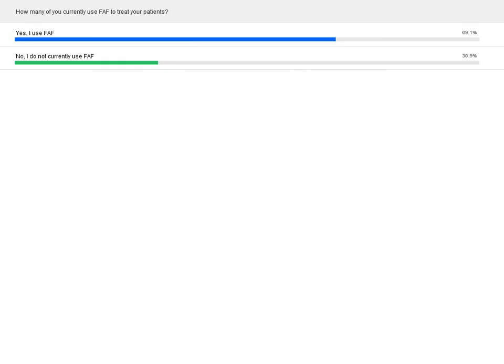Okay, yes I do, and no I don't. So we have more yeses than nos, which is great, actually. I'm a little bit surprised. I think in the real world, I don't think more than 5% of optometrists actually use autofluorescence at the present time. But those numbers may be inaccurate. It's hard to get those numbers.